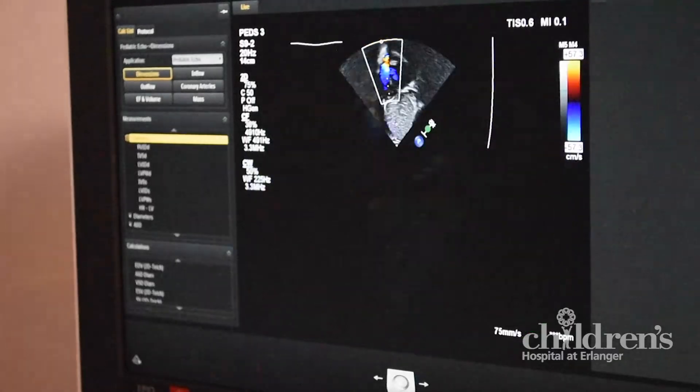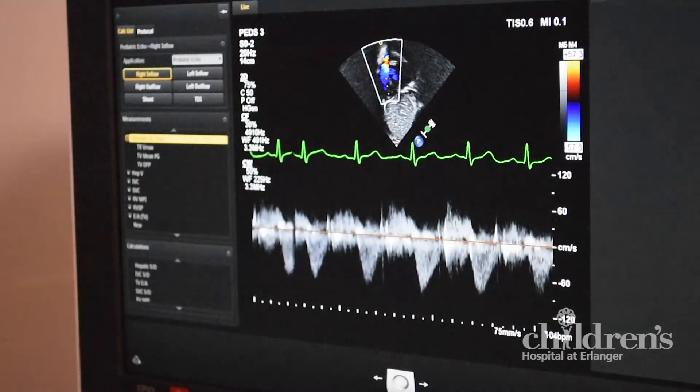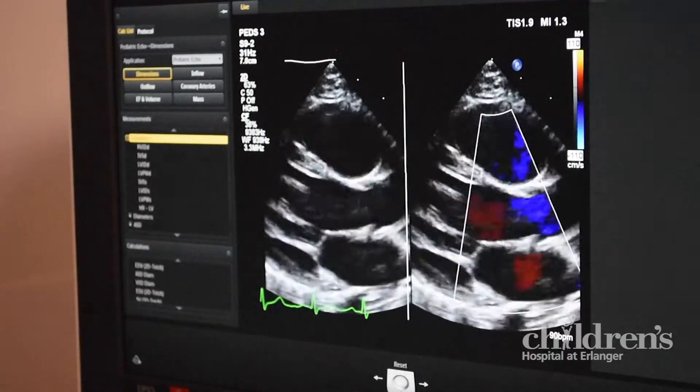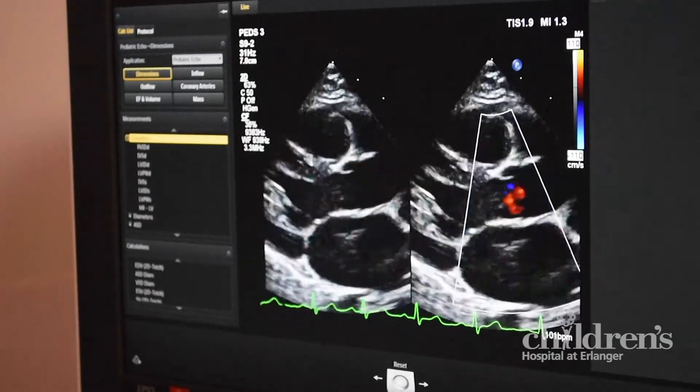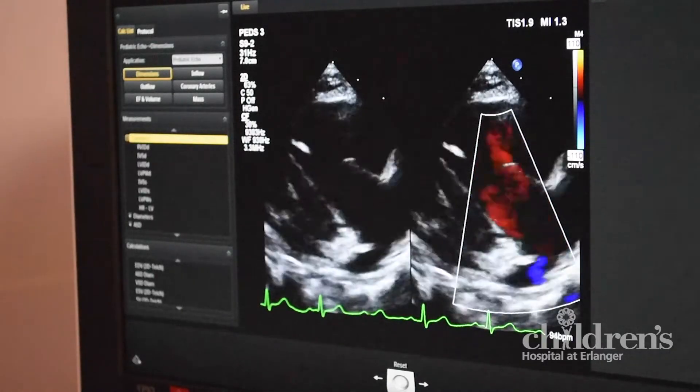The colors you see on the screen are not the colors of your blood. The colors tell us what direction the blood is flowing. The red color shows the blood flowing towards the camera, and the blue color shows blood flowing away.